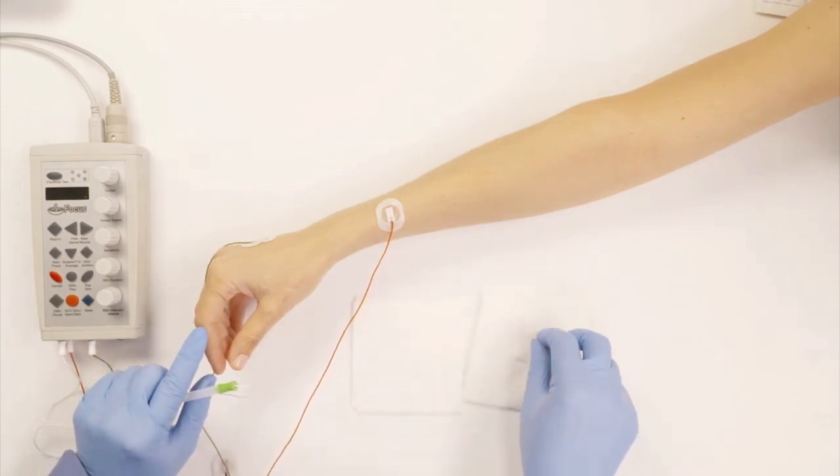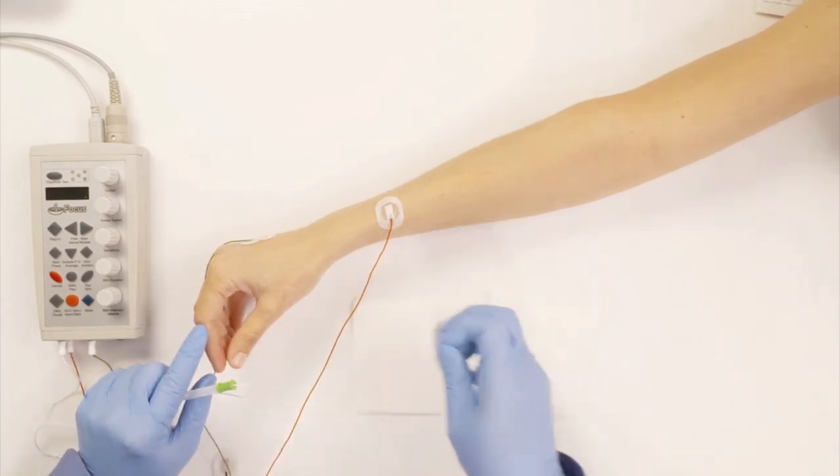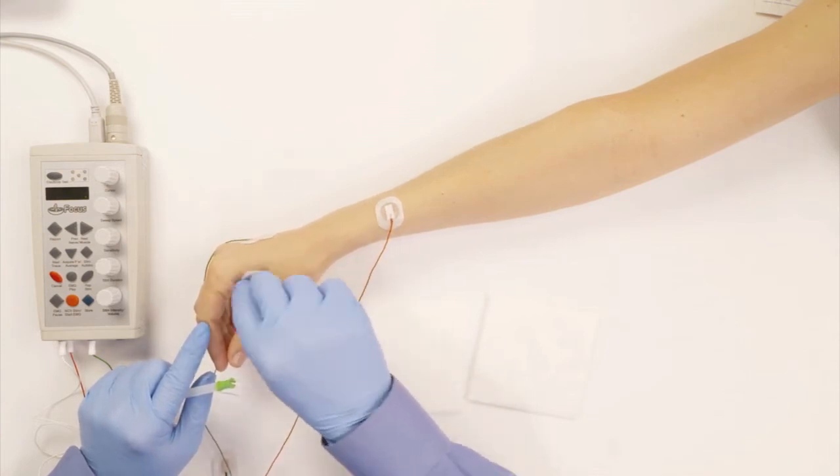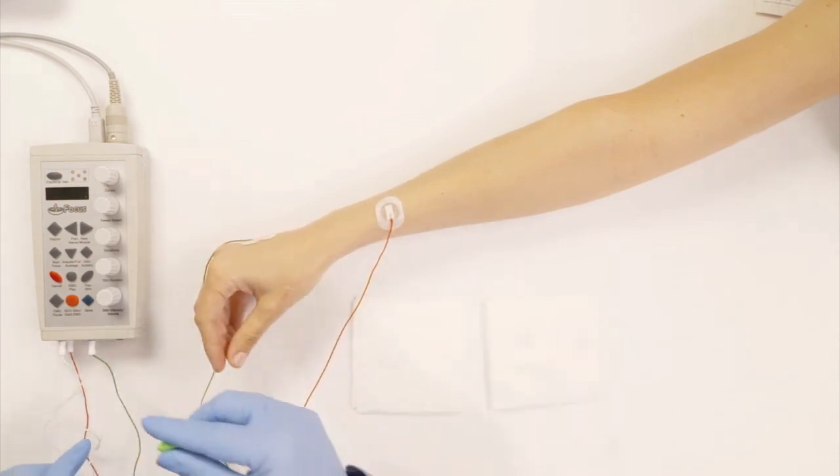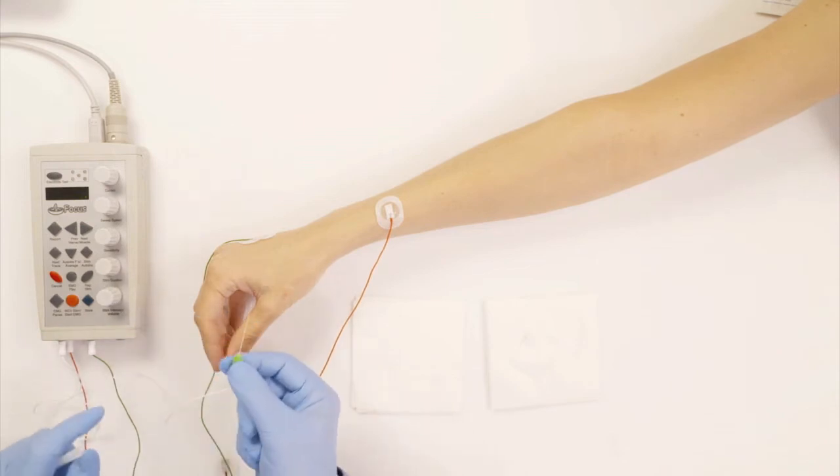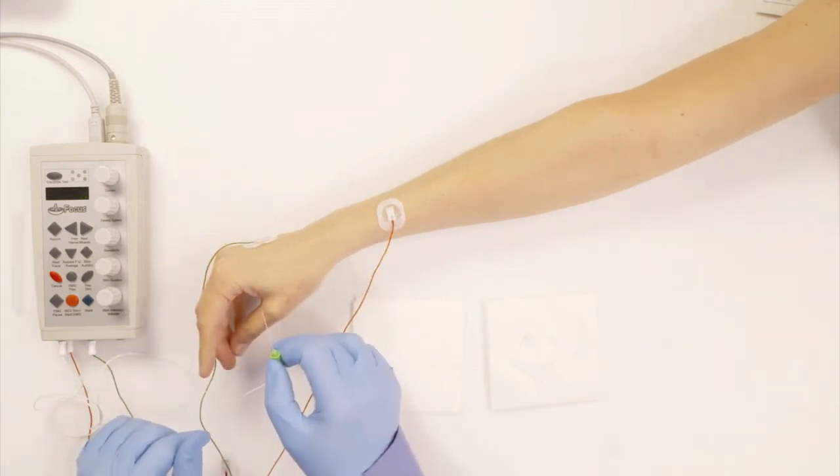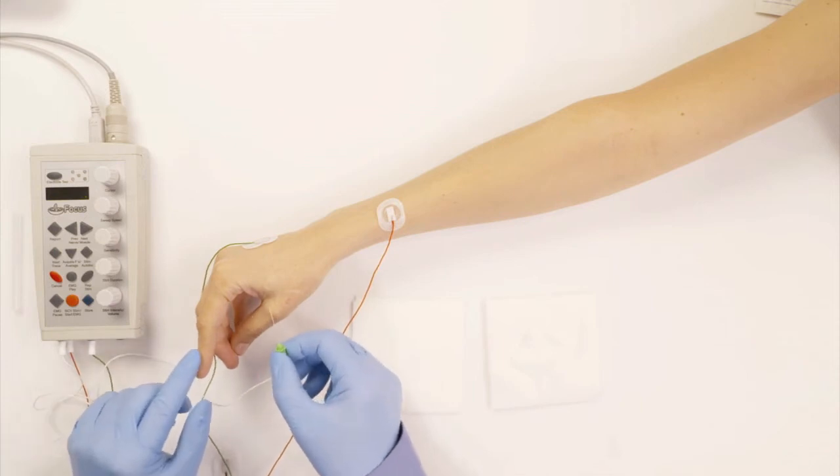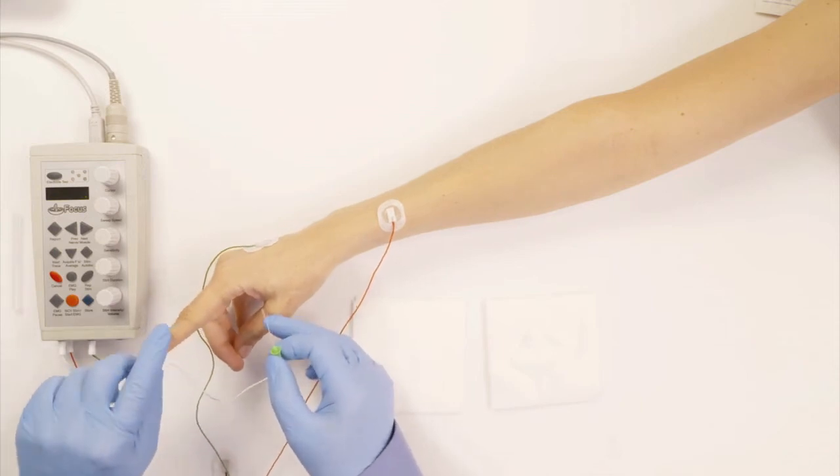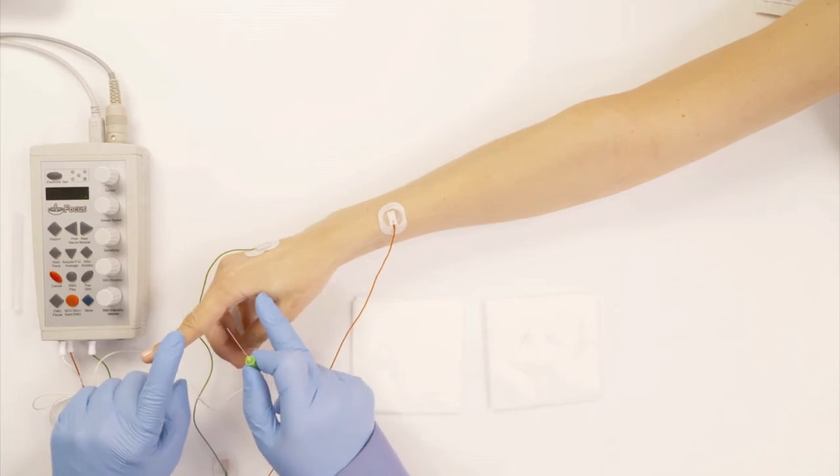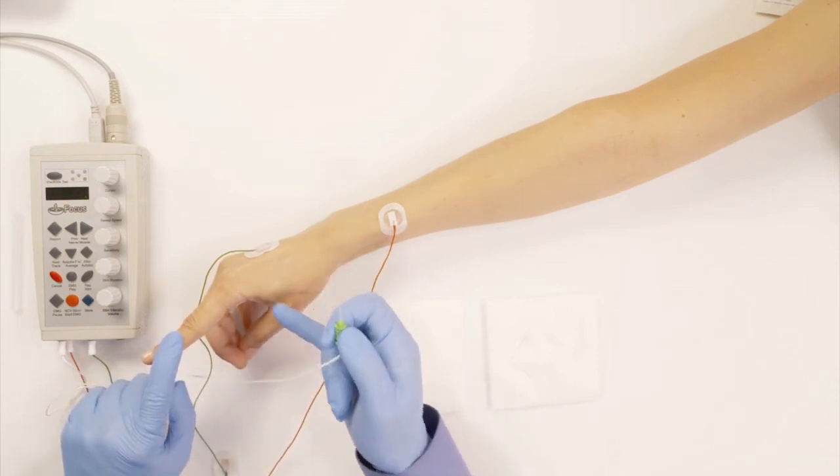So the first thing I do is I'm going to wipe the skin with the alcohol swab. And then this is the needle. And we're going to insert the needle in the muscle. So to find out where the muscle is so that I can stick the needle, I'm going to ask you to activate the muscle by lifting the index finger up. And you can tell right here that this is where the muscle is.